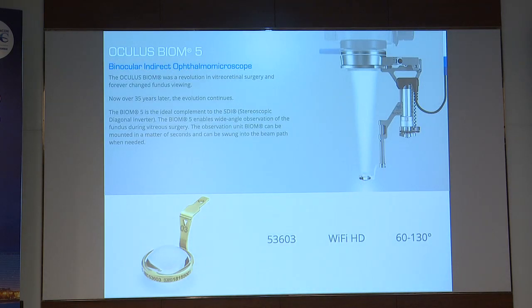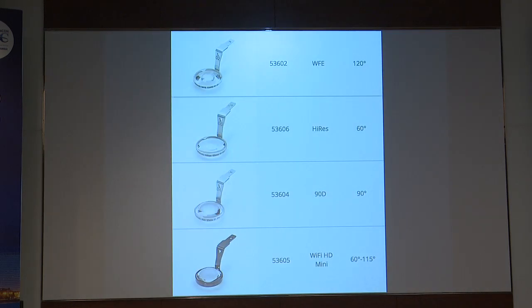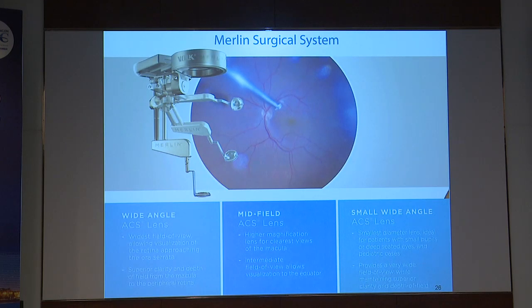Oculus is one of my favorites because of sheer ease of use and the quality it offers. The most favorite part here is the golden lens which they offer, which is actually a combination of a macular plus a wide field. You can do all maneuvers with this. Of course, they have the other range of a wide field 120 lens with a mid field 90 and a macula 60 and a small pediatric lens as well. The Merlin system is very similar to the Oculus system. It offers a wide field lens, a mid field lens, and a small lens for pediatric surgeries.